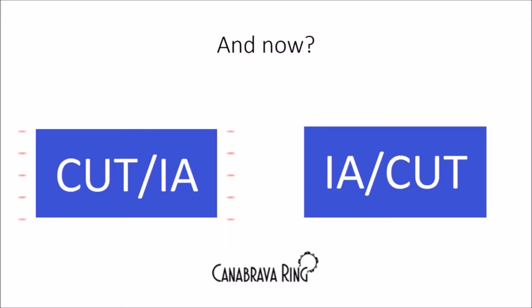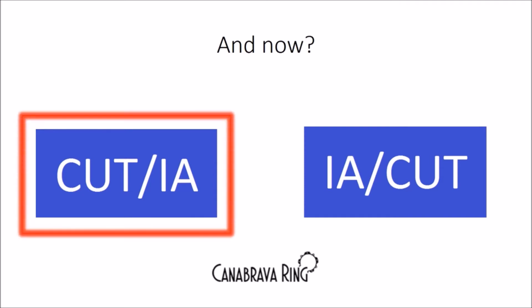The next question: some surgeons have this doubt — what do I use first, cut-IA or IA-cut? The answer is cut-IA. First you need to cut the vitreous, and after that, aspiration.